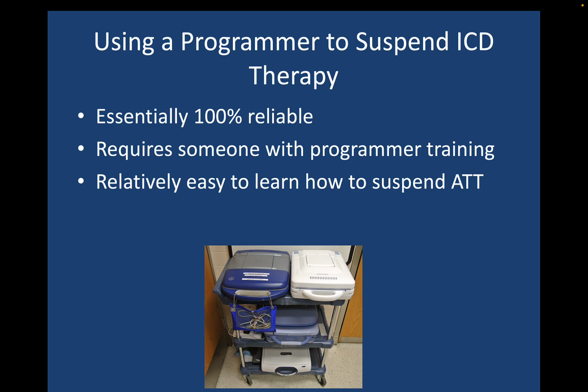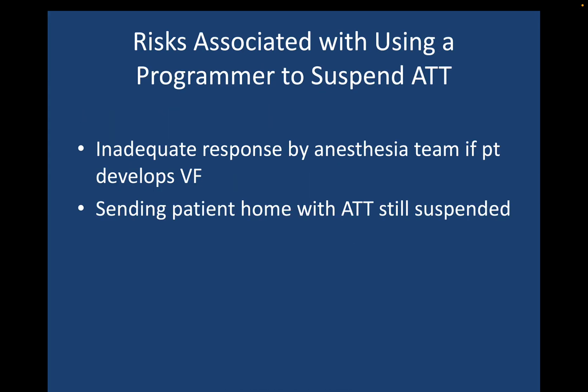The Medtronic device is a little bit harder to turn off the anti-tachytherapy, but again, eminently easy to learn. Now, of course, there's risks associated with using a programmer, and I don't want you to think that that's the perfect solution. But there's always the risk that if you turn off an ICD with a programmer, if the person who's in the room taking care of the patient doesn't know how to treat the VF because they don't know how to use the defibrillator, or if there's no defibrillator available immediately, then that can be a major problem.